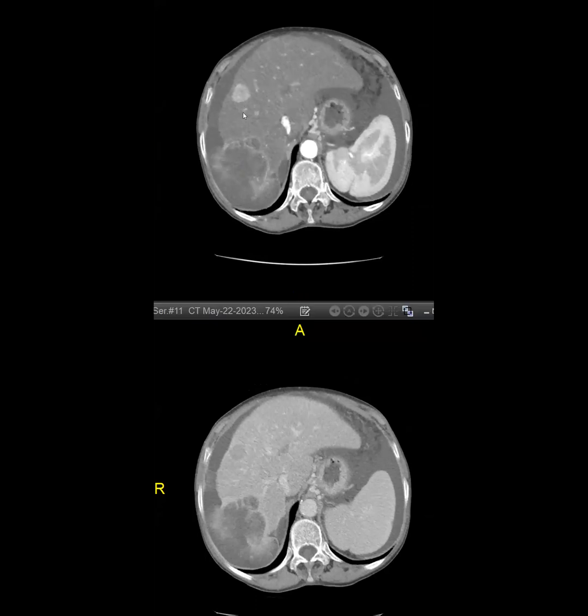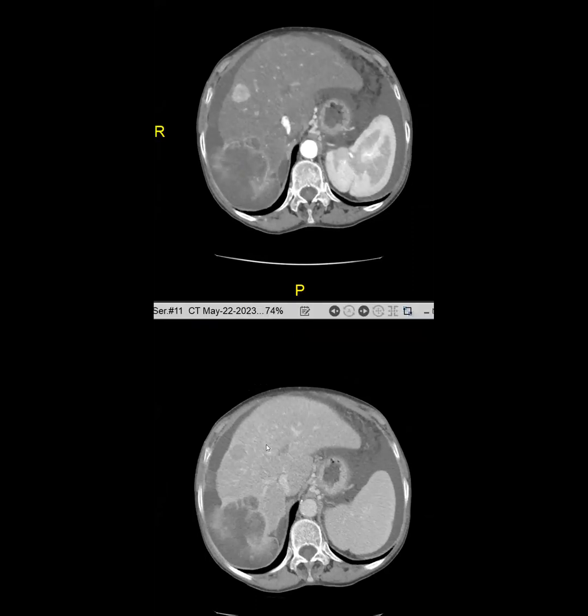So the interesting situation is what to do with the two additional lesions which look like LR-5? They're distinctly different from the big one. Should we call them LR-5 HCCs? Should we biopsy them to confirm?